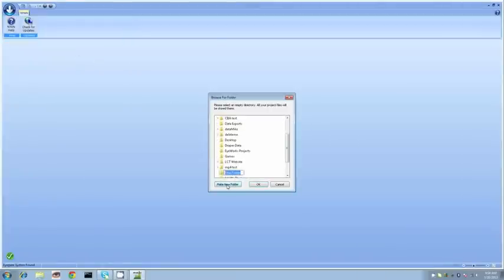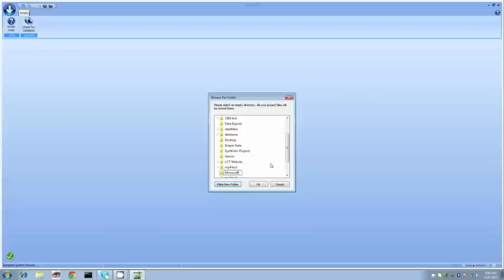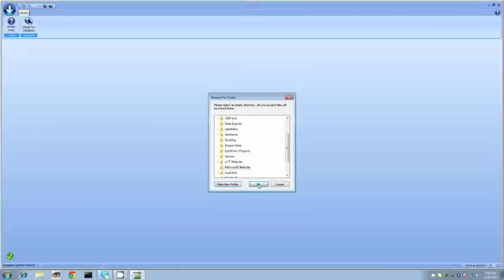I'm going to create a new folder. We'll call this Microsoft website. Once I enter this information we simply click OK and this is going to bring us right into the experiment.